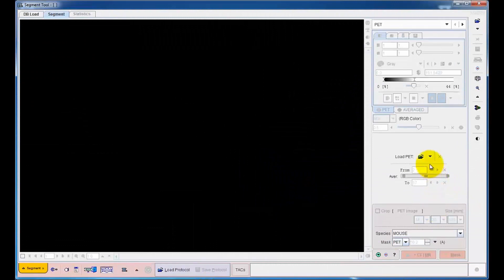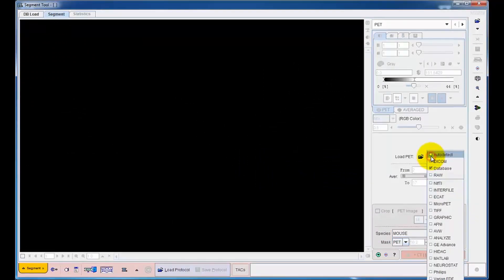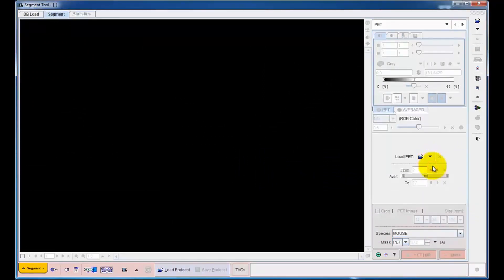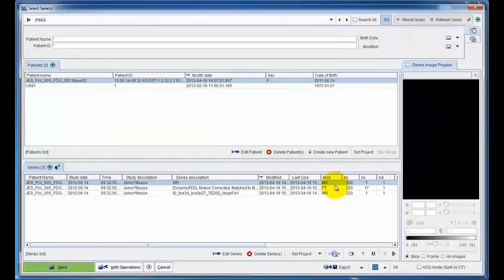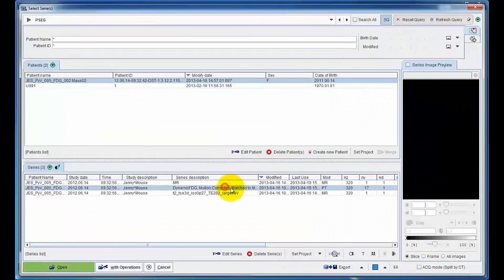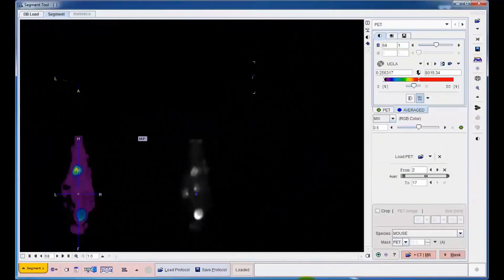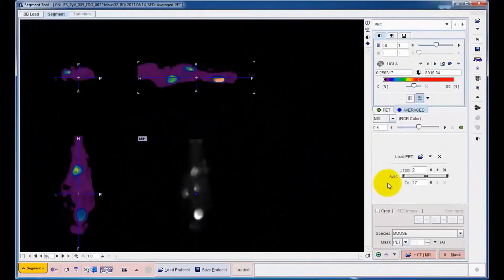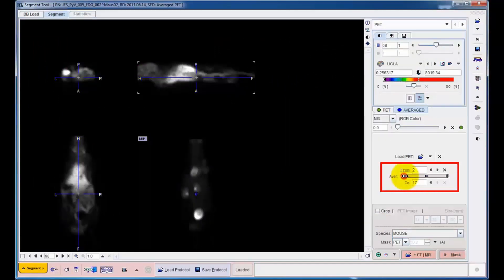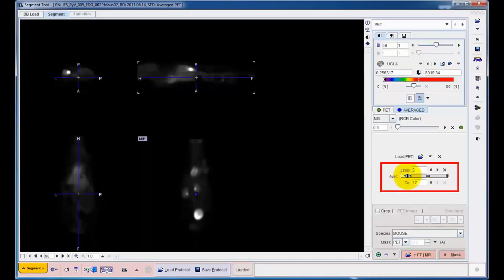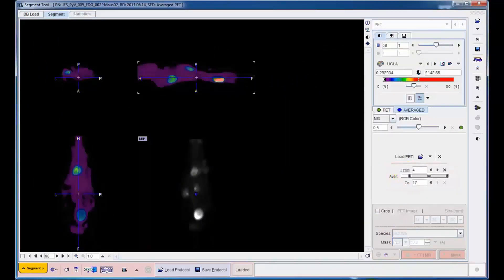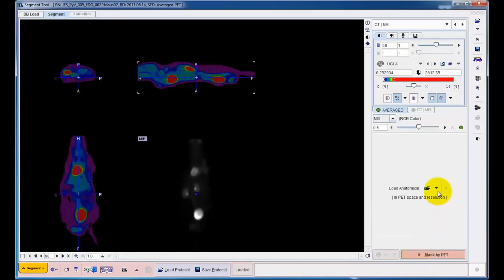Processing starts by loading the dynamic FDG PET series, which has been motion corrected in PMOD's fusion tool. The uptake from the end of the perfusion phase until the end of scanning is averaged for later reference. Next, the matched MR images are loaded and fused with the averaged PET.